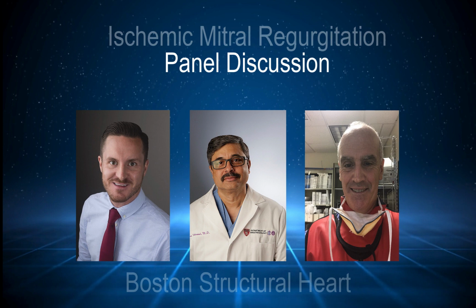Yeah. I mean, it's a relatively easy concept to do with the advent of 3D echo. So, using a tenting volume as opposed to just a single tomography area maybe gives a broader or a better, fuller picture of the 3D nature of the valve.